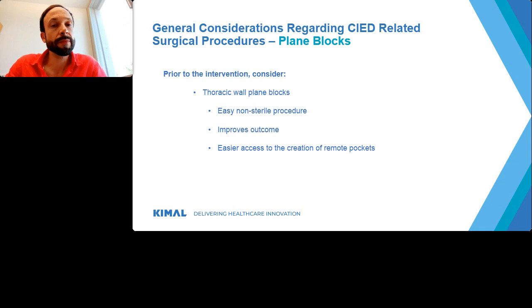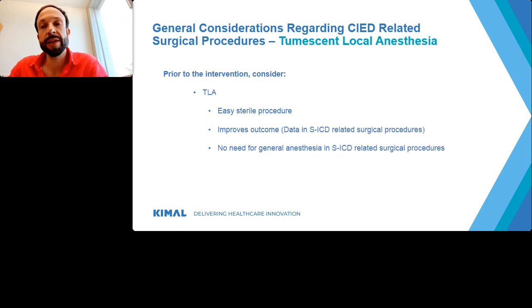Okay. Another way of local anesthesia is tumescent local anesthesia. There have been recent publications regarding, for example, CIED implants. It's an easy sterile procedure, meaning that the patient is already prepared and draped and washed down for the procedure itself. It improves outcome.